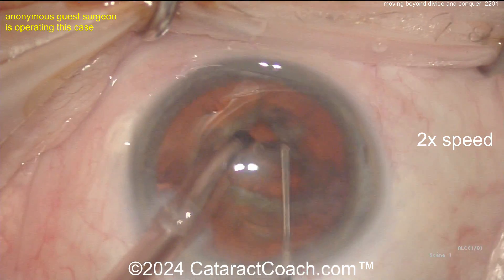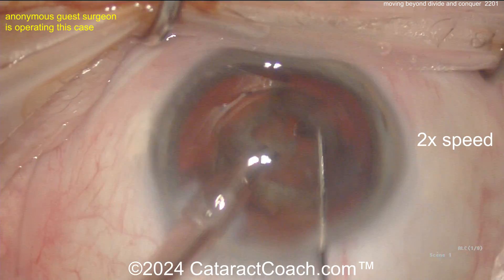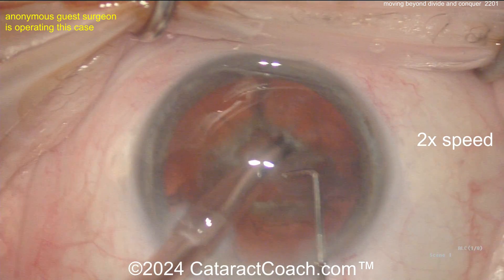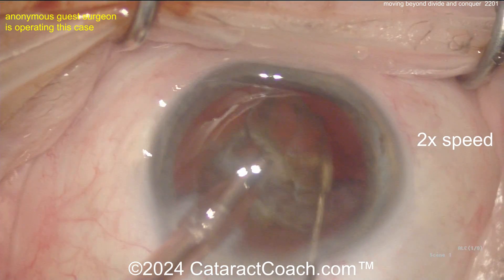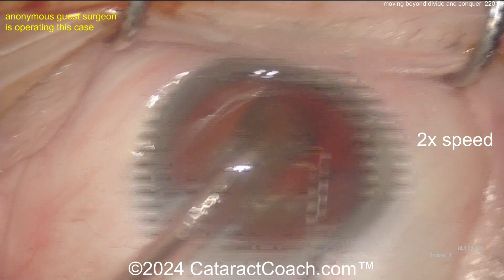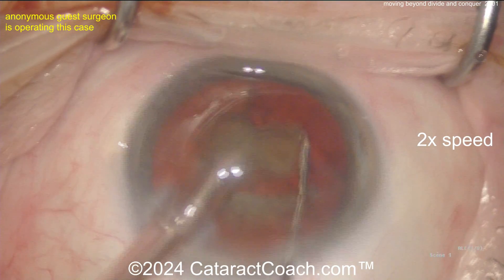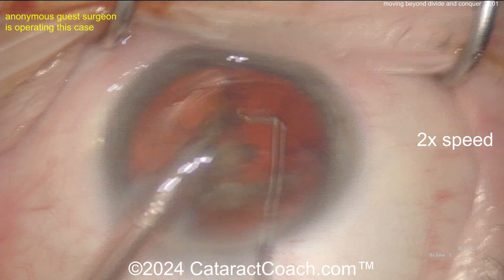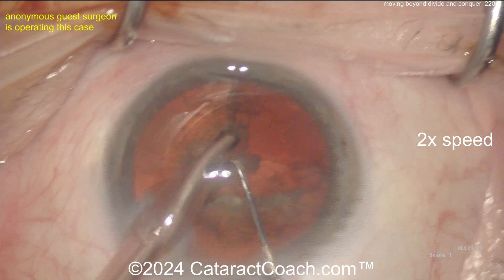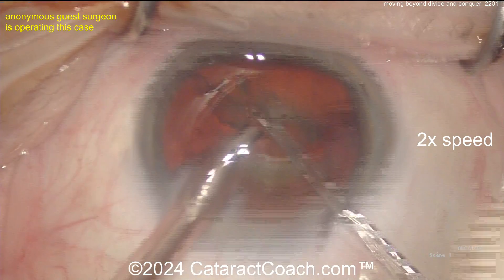This is not looking too well — I can see the eye is not in primary anymore. The eye is kind of being pushed away from the phaco probe. There's a little piece coming up and there's kind of a pretend chop. Let's get that one quadrant out, let's get the eye back in primary. Quit lifting up the phaco probe hand — lower the hand a little bit, get the eye back in primary. There we go.